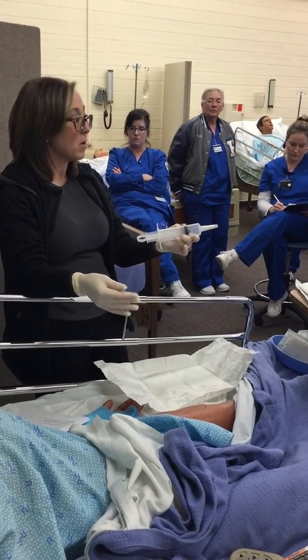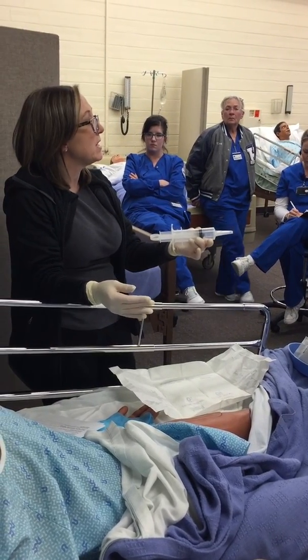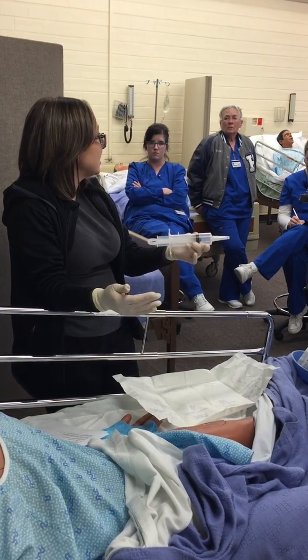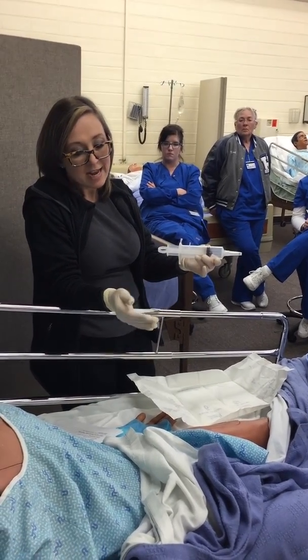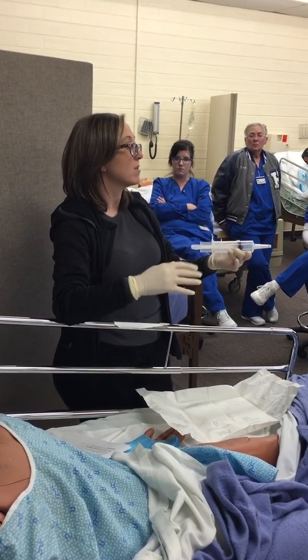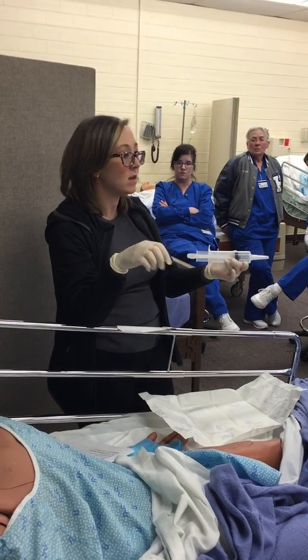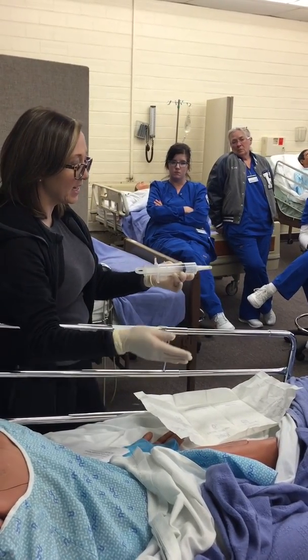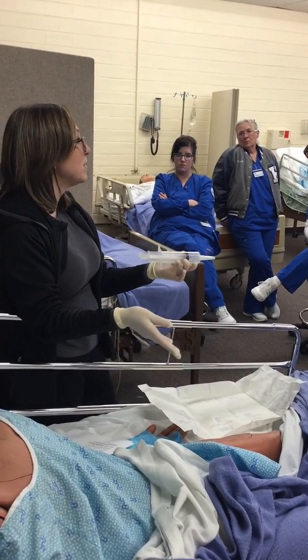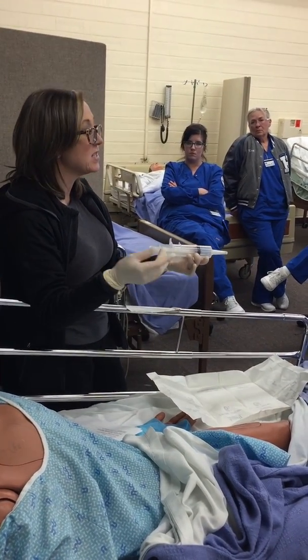And this is on the lateral part of the leg. Whenever you're irrigating, you need to position them to facilitate drainage. So if it was on his bottom, I would have him on his side. If it was on his abdomen, I would probably put him on his side again because you want that drainage to go downward, not to sit in the wound. You guys see what I'm saying? So this is on the lateral aspect of his leg, so it's going to facilitate downwards. And there's a chucks underneath him because you would want to put a chucks under there because all this stuff has to go somewhere.